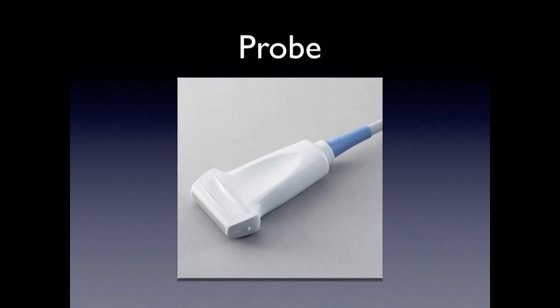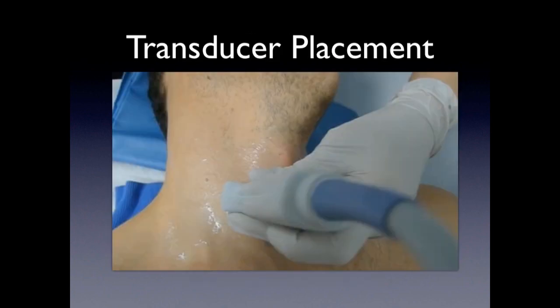We are going to be scanning with the vascular probe — it's a high frequency probe and it gives us great images. We're going to make sure we are in between the thyroid cartilage and the sternal notch, which is the area where the thyroid is located, and we're going to have the indicator probe pointed towards the right of the patient.